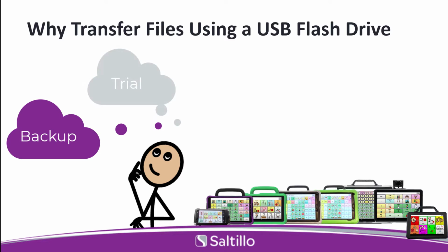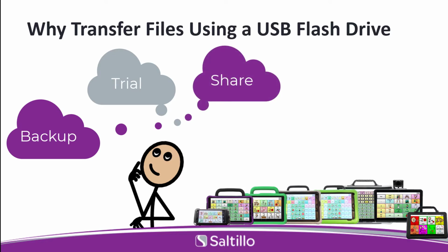Maybe you are in a trial device now. As you trial the device, you will likely customize the vocabulary. Saving your customized vocabulary to a flash drive will make moving to your new device a snap. You may also want to share the customized vocabulary with a team member, such as a parent, SLP, teacher, or anyone else on your team. That way everyone is part of your AAC journey.